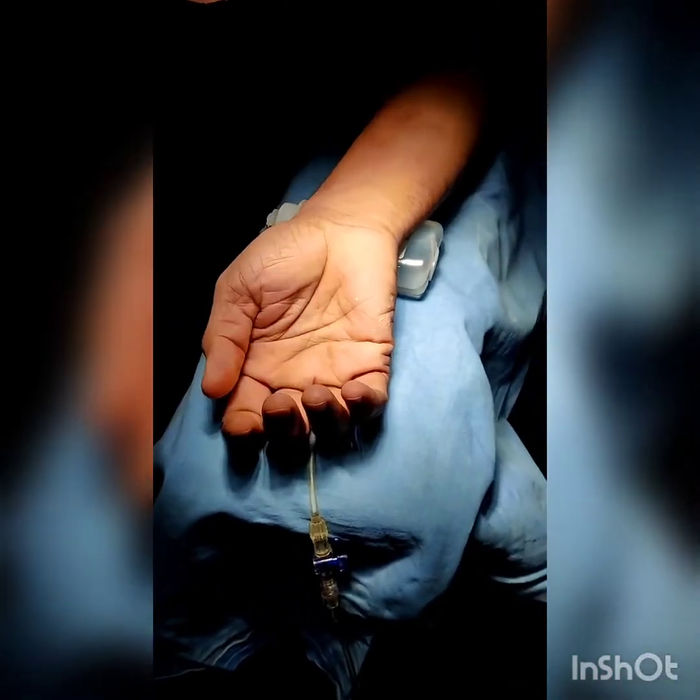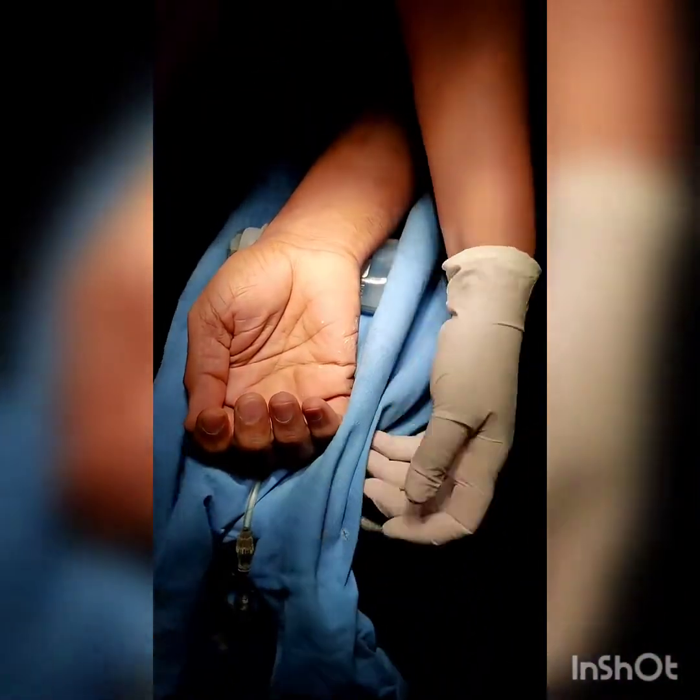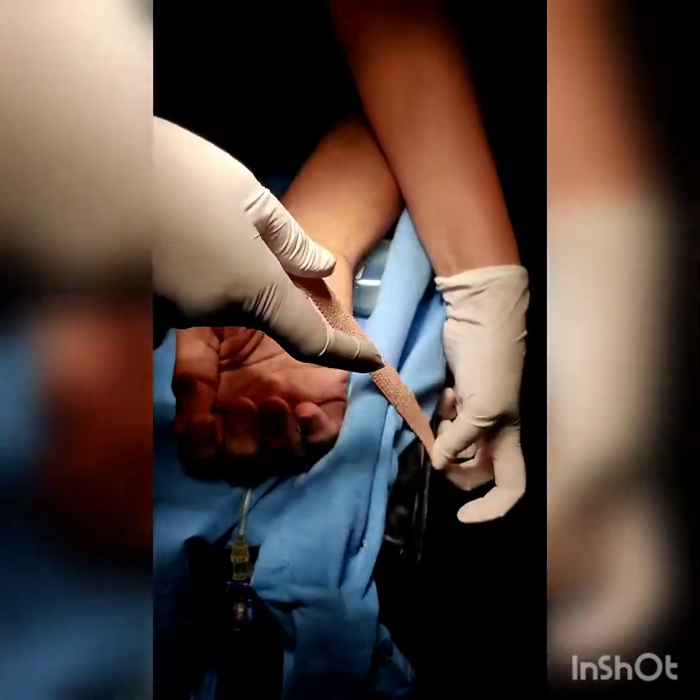For the arterial cannulation, the patient lies in supine position with his entire arm outstretched and rested over the handrest. A small roll of sheet or a 100ml saline bottle is placed under the forearm just proximal to the wrist, and the forearm and hand are taped down to the handrest.